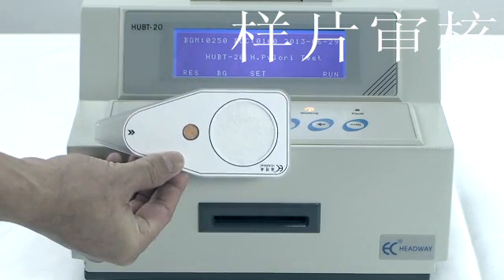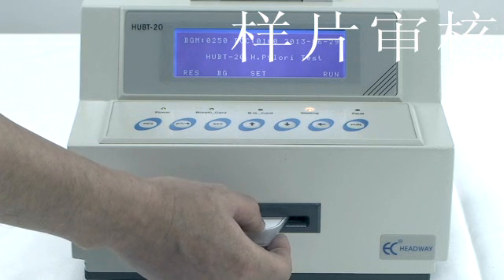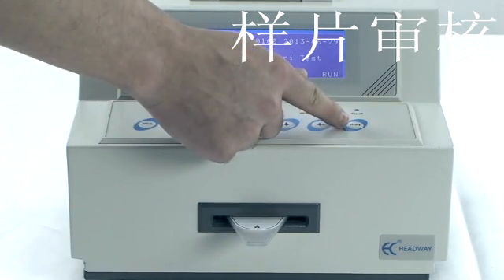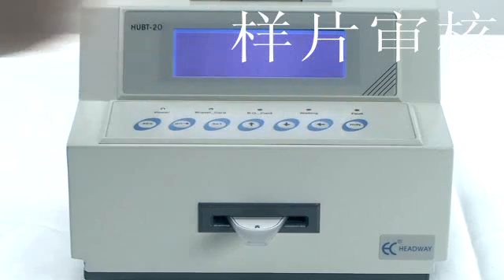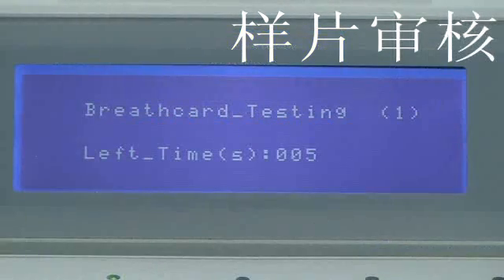For sample measurement, insert the collection card into the measurement room and press the run key to start the measurement. The measurement time is defaulted to 250 seconds.